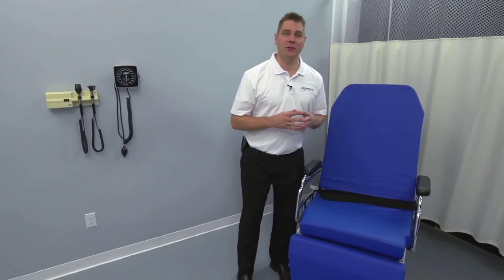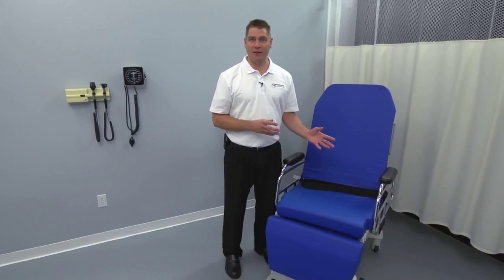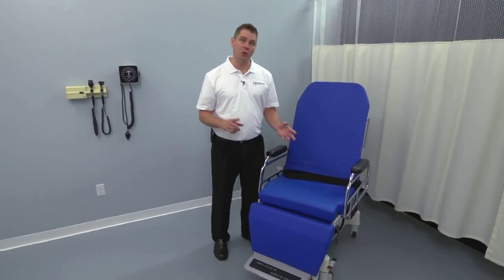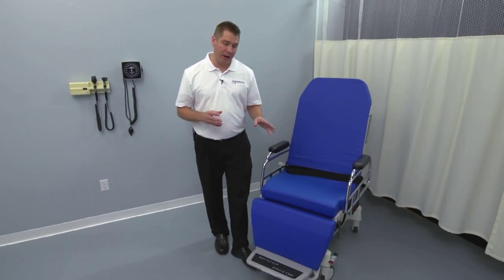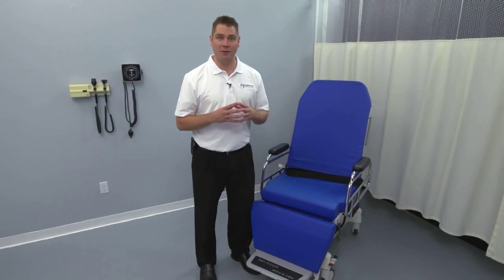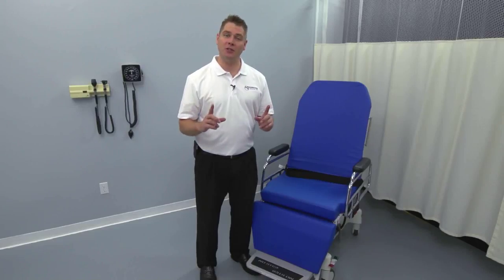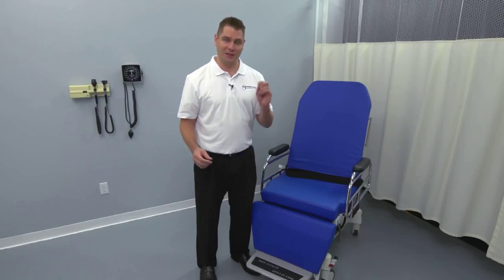Welcome and thank you for choosing TransMotion Medical's TMM4 multi-purpose stretcher chair. In this overview, we're going to cover all of the essential information you will need to operate and maintain the chair. You'll see how every element of this transport and treatment device has been designed with the caregiver and the patient in mind. Should you have any additional questions after watching this video, feel free to contact your TransMotion Medical representative. Let's get started.